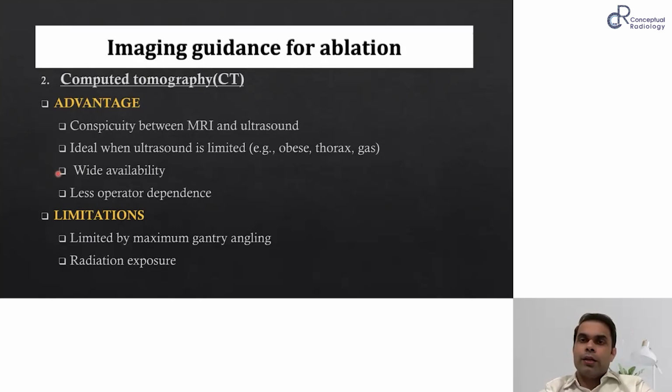As compared to ultrasound, the operator dependence is less. You can actually see the ablation zone post the CT. You can keep a record for later that this is where the probe was, this is how the ablation zone formed. And the problem is the radiation exposure to the patient. Of course, to you it's not that much because you can always come out, but a bit of radiation exposure, and slightly difficult to monitor in real time. You cannot change. You have to come out, see the CT again, then again go back, change your position. It takes a little longer.